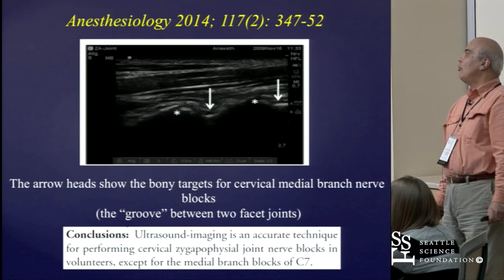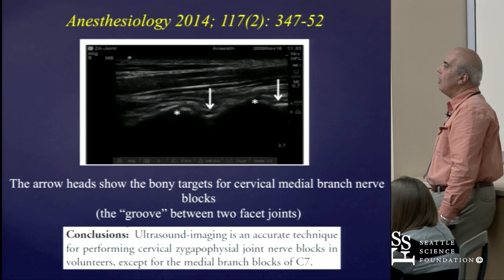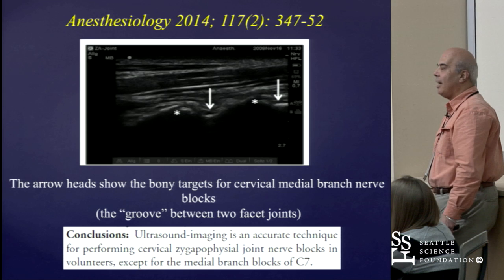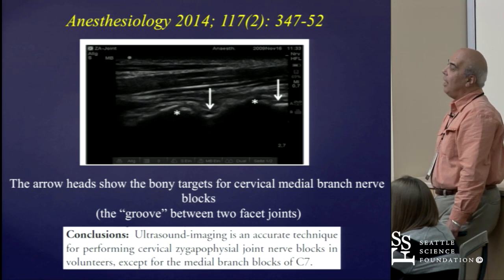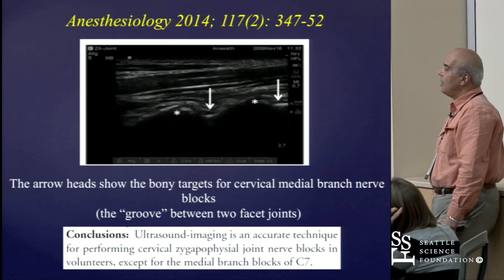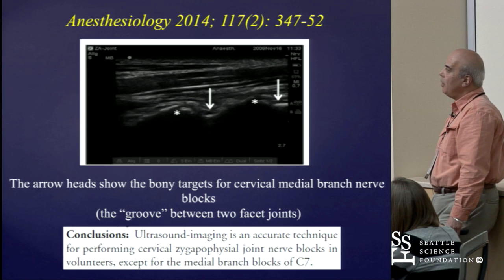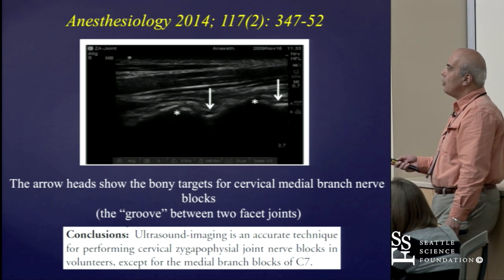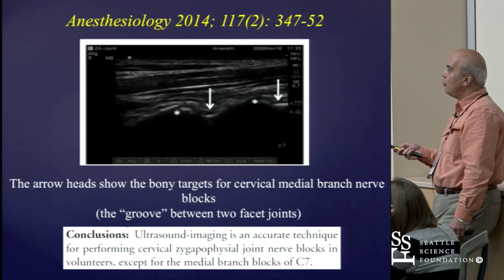There is an increasing interest in performing this procedure with ultrasound guidance. I have to admit I have not done any of this under ultrasound guidance. I did not grow up in my training performing this procedure under ultrasound guidance. So I show you what I found in reviewing some of the literature.